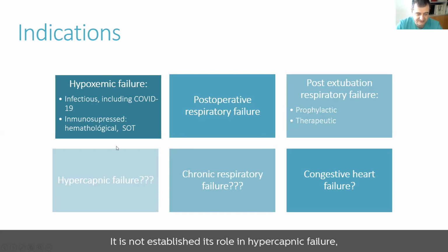Its role in hypercapnic failure is not established, probably NIV is superior in that setting, nor in home care, although there are some ongoing studies regarding this use. And also for congestive heart failure, there are some studies that may reflect some utility in this setting.